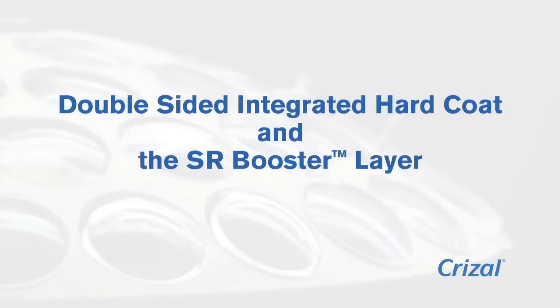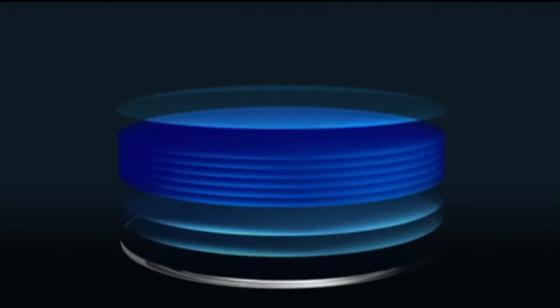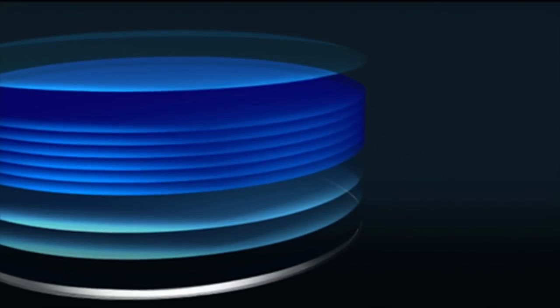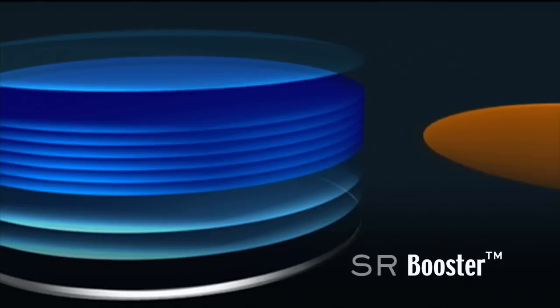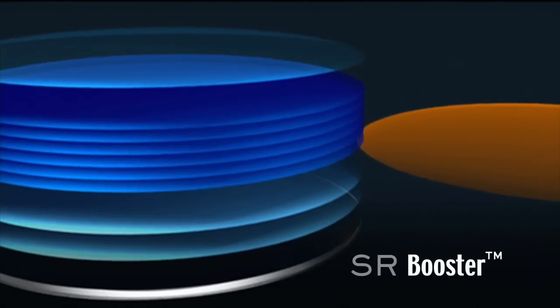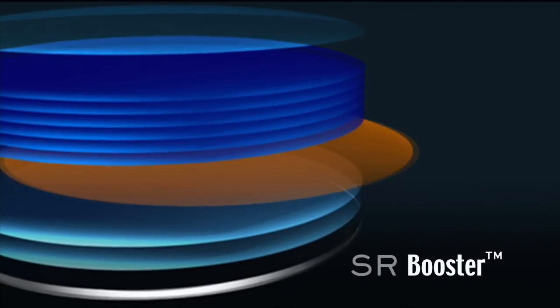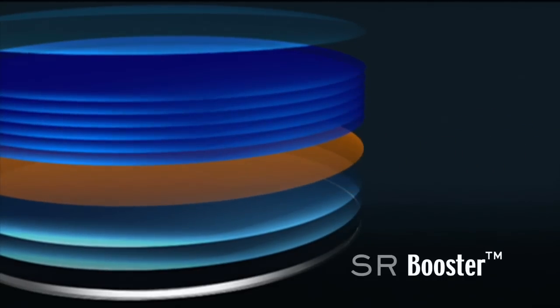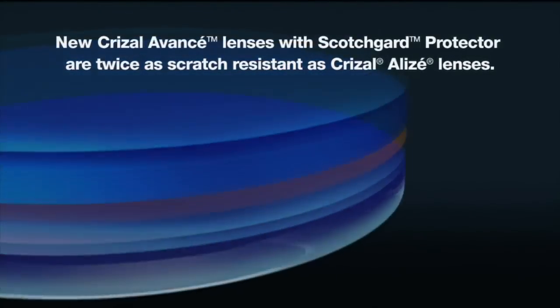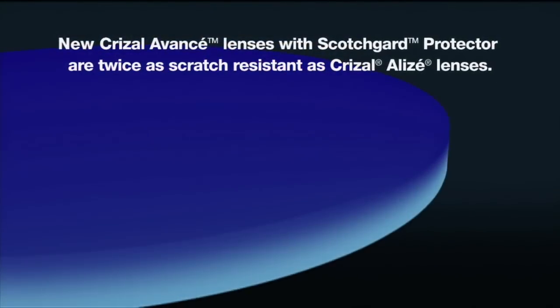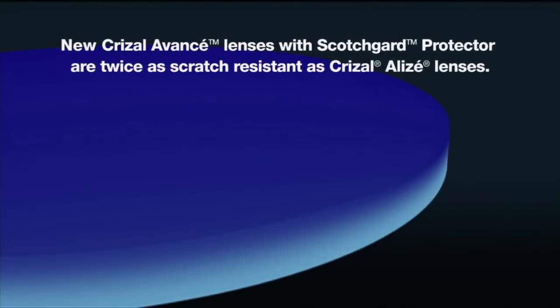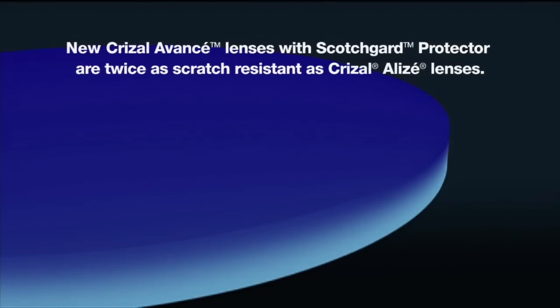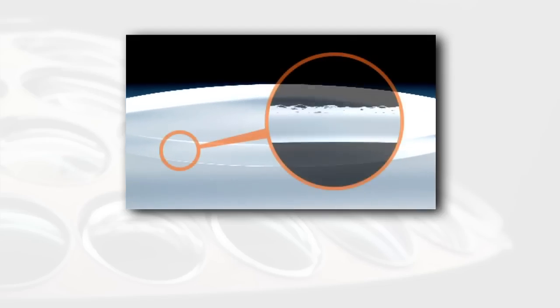A double-sided integrated hard coat is the core for the superior scratch resistance of every Crizal job. When the exclusive SR booster layer is added between the hard coat and the AR layers of the Crizal Avance with Scotchgard protector lenses, they become twice as scratch resistant as Crizal Alize lenses and the most scratch resistant lenses on the market.